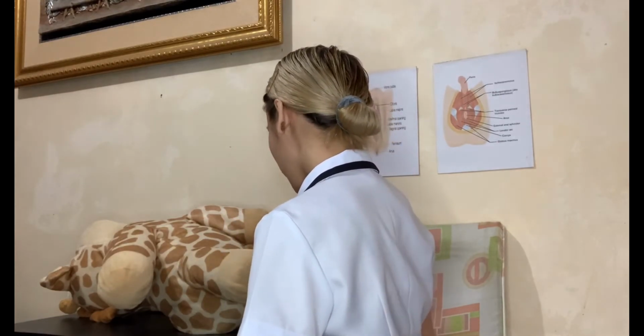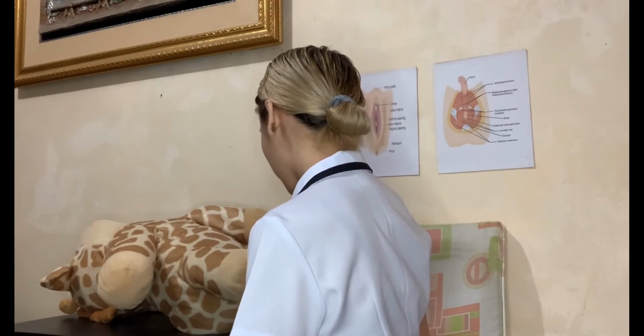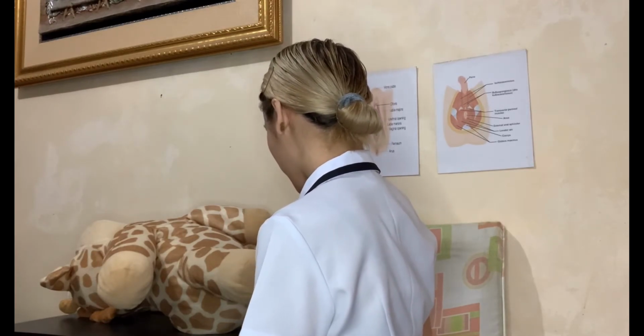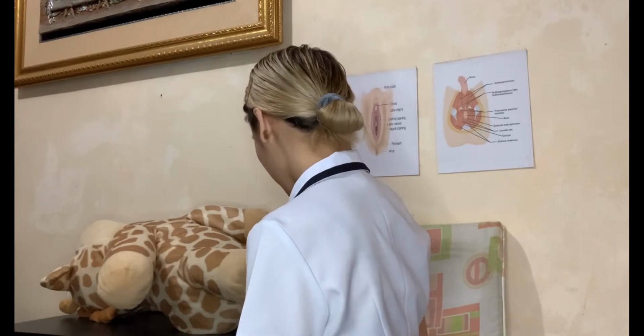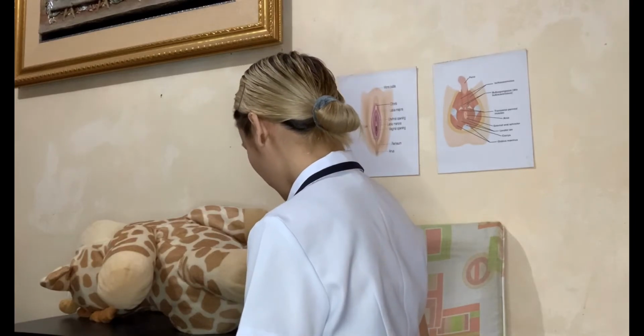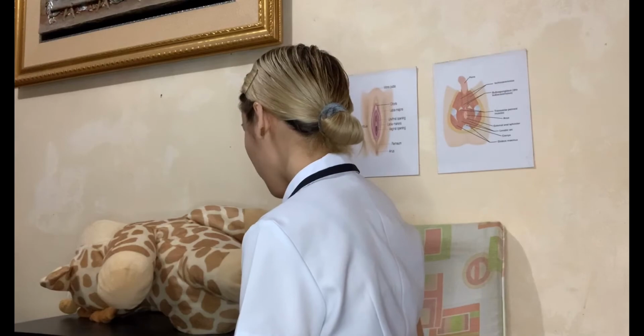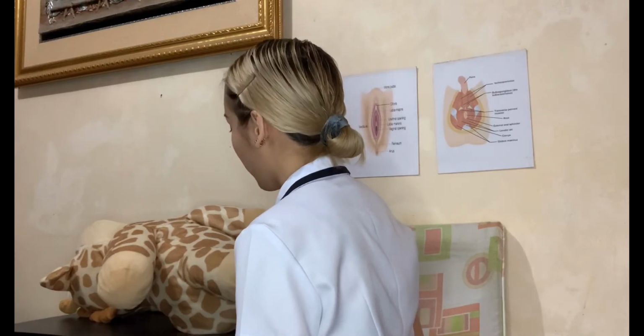This is to relieve discomfort due to bladder distension or to provide gradual decompression of a distended bladder. This also assesses the amount of residual urine if the bladder empties incompletely, as well as to obtain a sterile urine specimen and to empty the bladder prior to surgery.